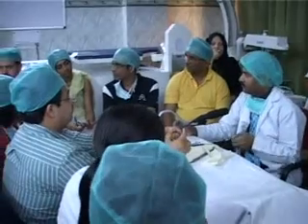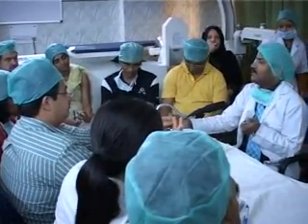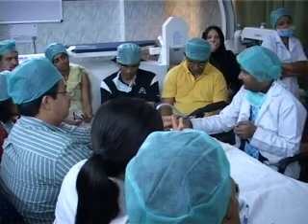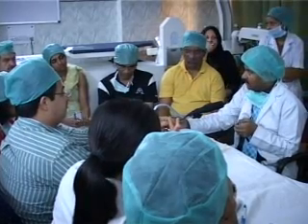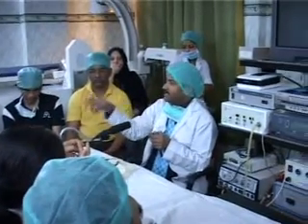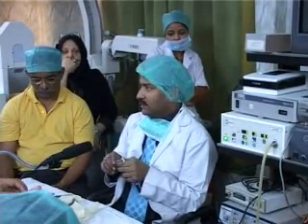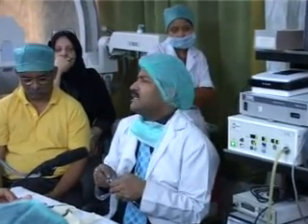So isn't that kind of a leak? Yes, suction irrigation is a kind of leak, but suction irrigation we use only if there is bleeding, isn't it? And at that time it is necessary. But if you keep on irrigating and sucking, then there will be much dryness. Even when we're doing the bipolar, we do that to release the gas. No, it is not necessary.